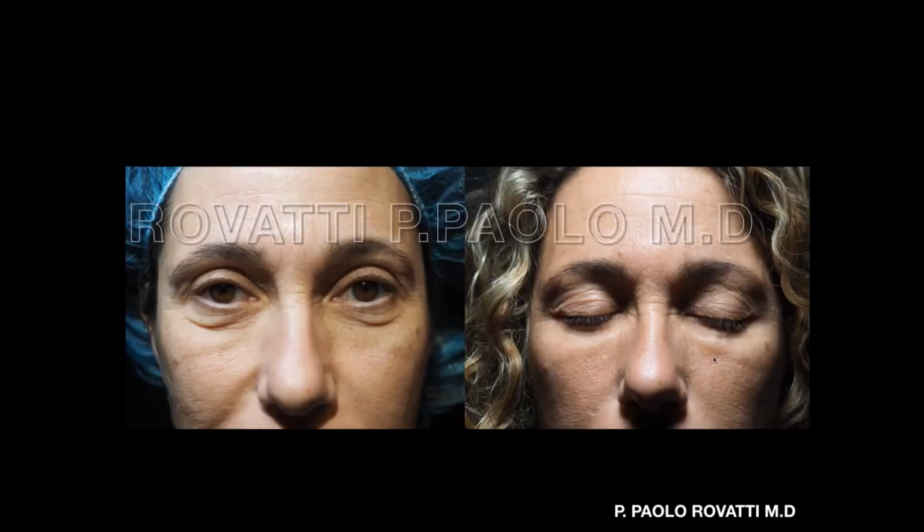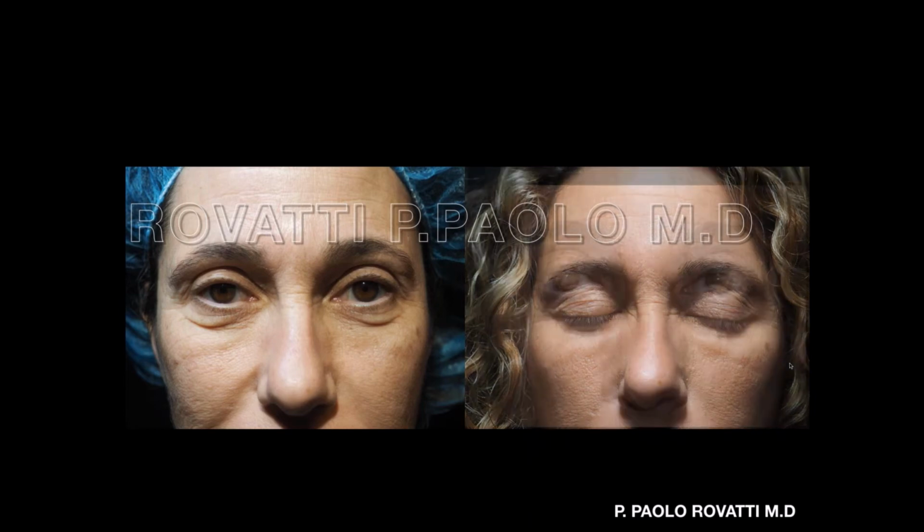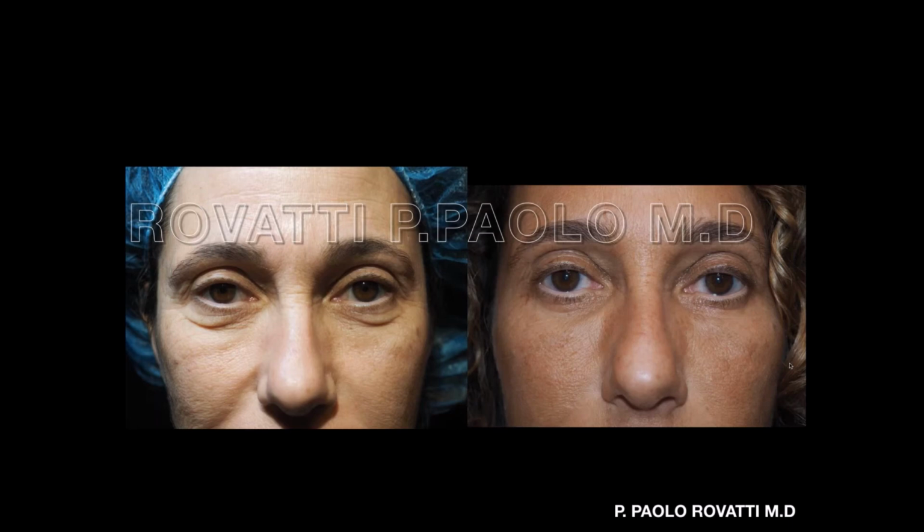Interesting, because I removed the skin. I just removed the skin. I didn't manage the fat pad because she didn't have a fat pad. And what I had, you can see on the right, there was a malar edema. This is a photo after a few months, still there. It was not going away. And the patient was complaining, now it is worse than before. What I did, I did AccuTite, and so I reduced this edema, this contraction. Well, AccuTite is not reducing the swelling, but maybe it is tightening the tissue. But this was, for me, a great save for me and for the patient.